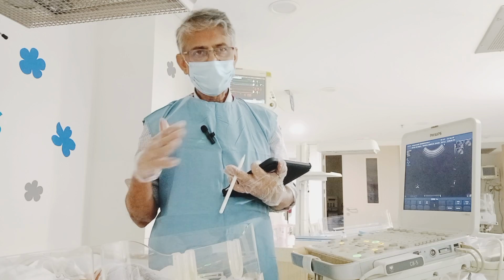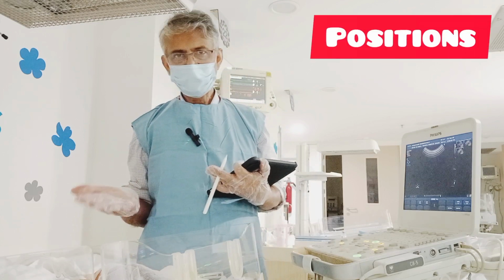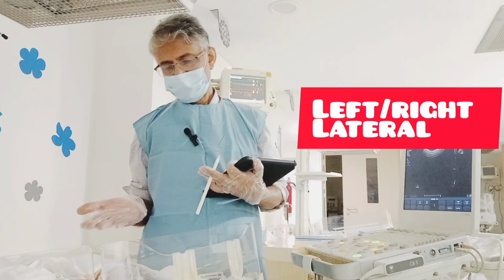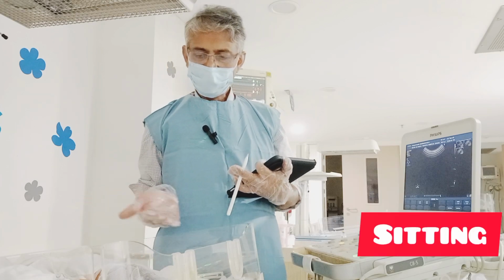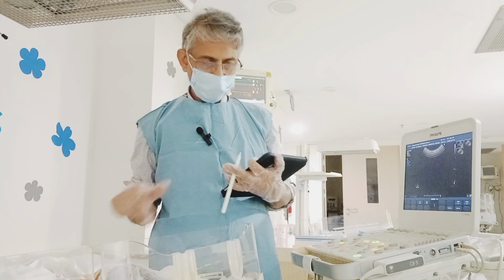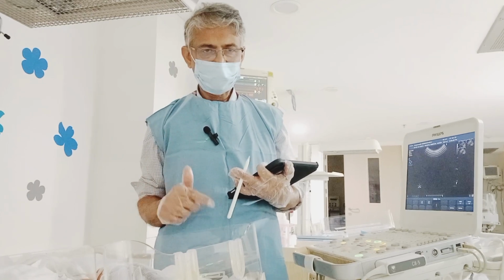Okay, and there are different positions we use for lumbar puncture. Commonly used is either left lateral position or right lateral position. Sometimes we use prone position and also the sitting position. And we document the spinal canal depth in all three positions before performing the lumbar puncture.